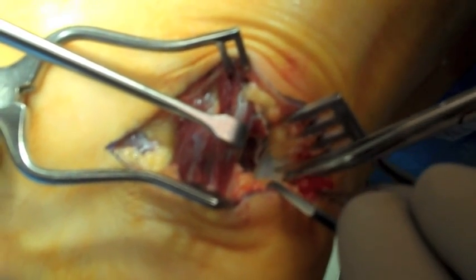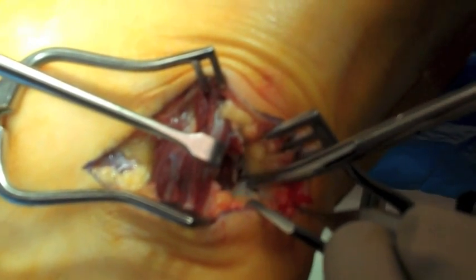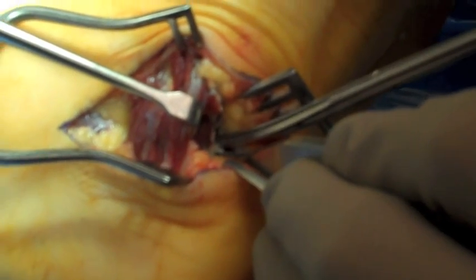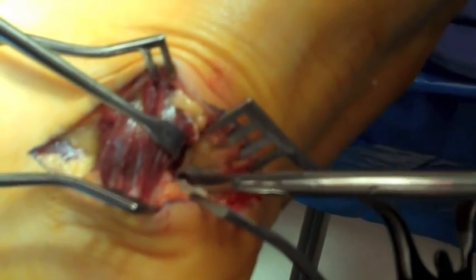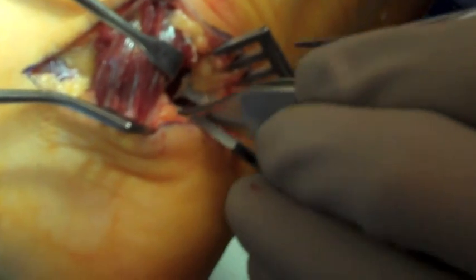This is releasing the medial band of the plantar fascia with Metzenbaum scissors. This will allow visualization of that deep fascia between the quadratus plantae and abductor hallucis muscle belly to complete the release that had been started along the more dorsal surface.